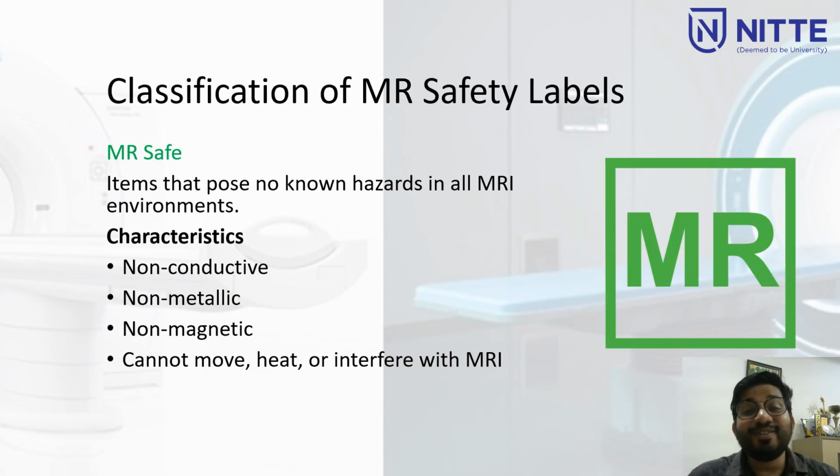So the first one is MR safe. Items that pose no known hazards in all MRI environments. So what are the characteristics? It should be non-conductive, non-metallic, non-magnetic, and also cannot move, heat or interfere with MRI.